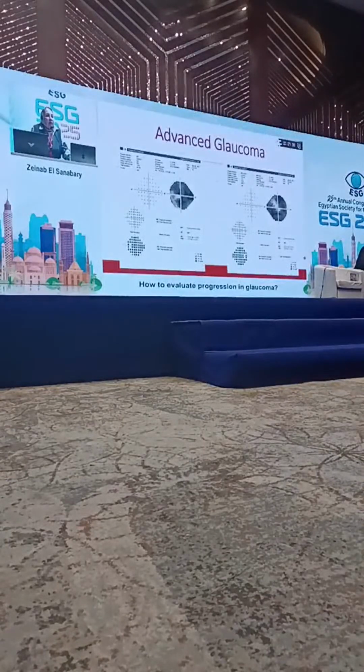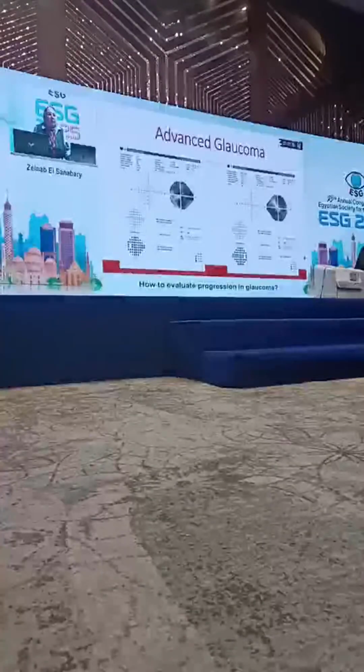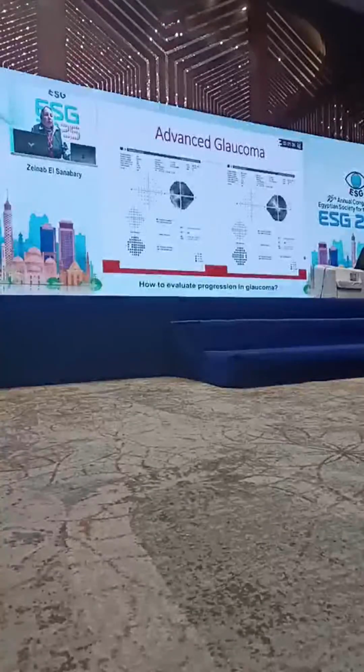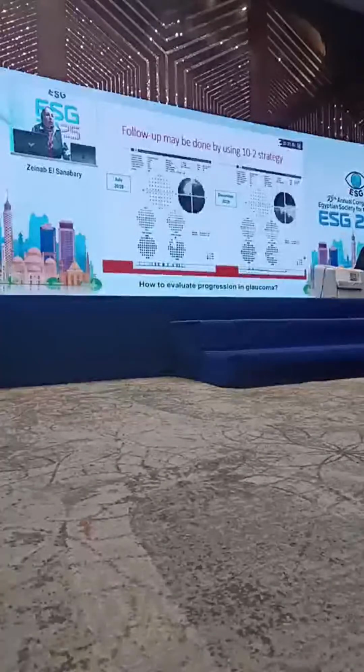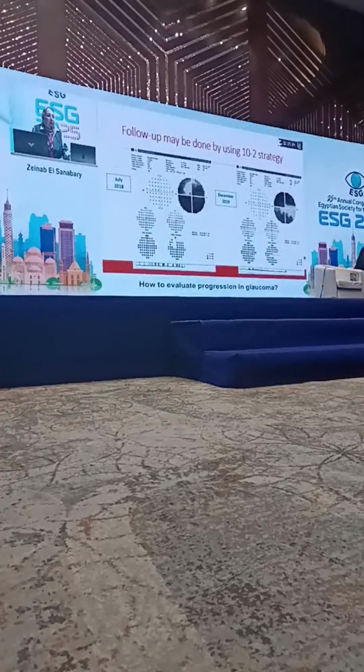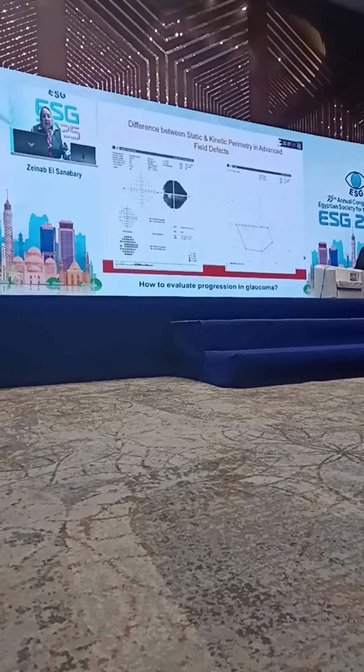In the case of advanced glaucoma like this, and this is the main question, how can I test for progression with this field? We usually resort to 10-2 in order to magnify the central area, which is usually the tubular field. And we may have this presentation giving hope for the patient that there is improvement. But sometimes, even with the 10-2, I can't do follow-up because I have a marked affection of the field.